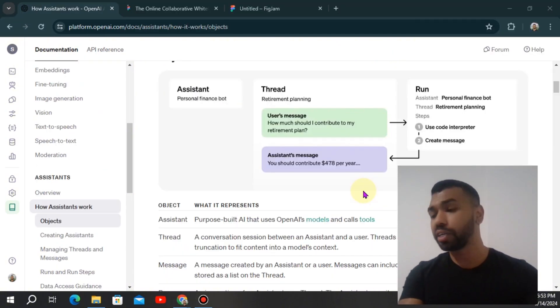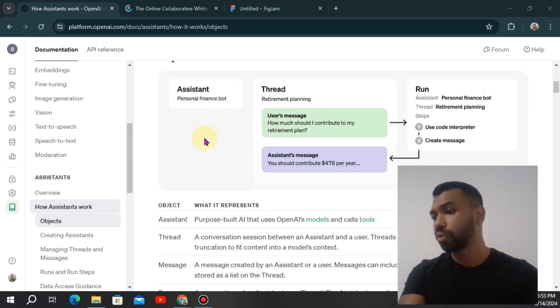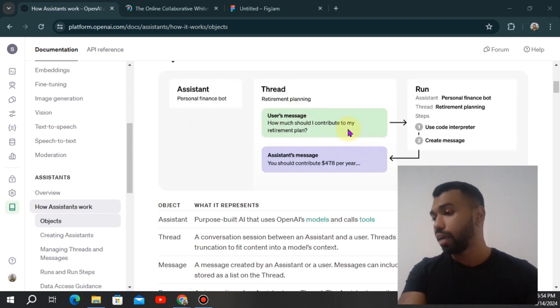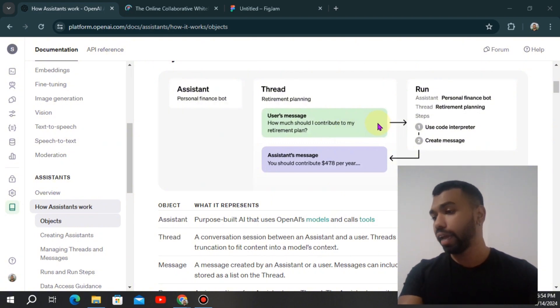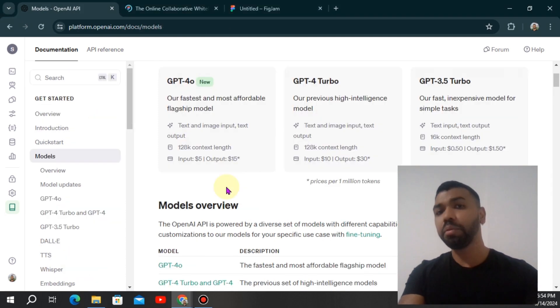You might be already familiar with the assistant framework. We're going to use the same framework as before, create the assistant, create the thread, and then the message body, we're just going to send off the image. Everything else is the same. We can set off the streaming capabilities as well. That's going to be in the run function.